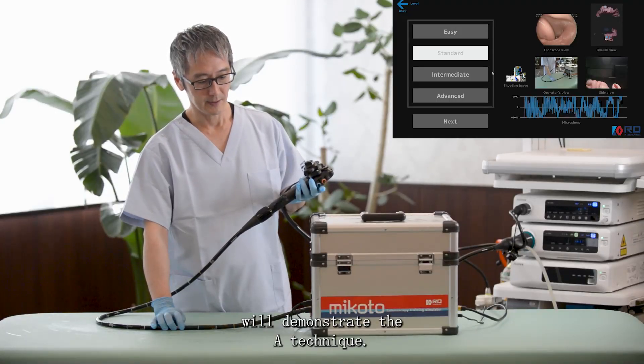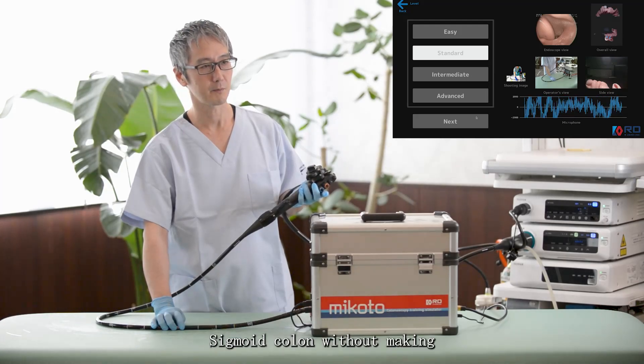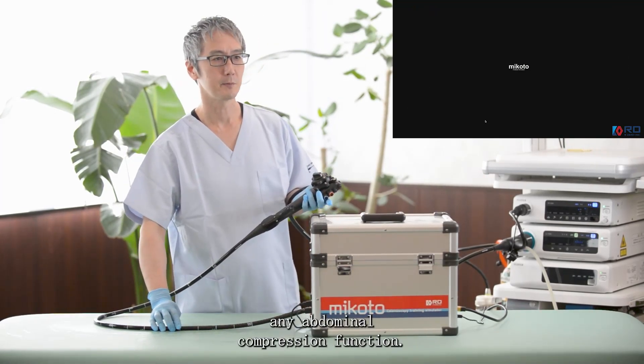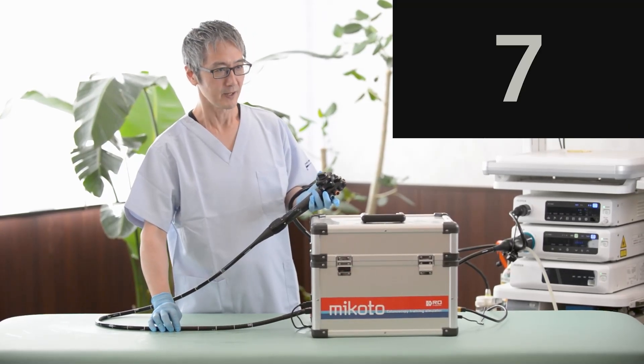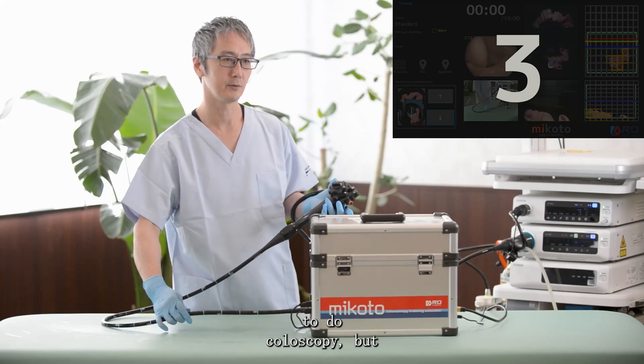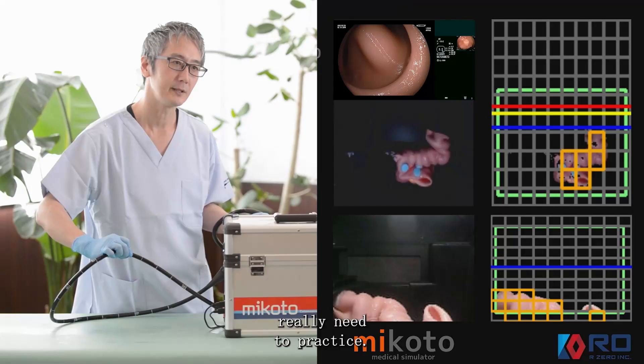Now I will demonstrate the A technique. This is trying to pass the sigmoid without making any loops and also without using any abdominal compression. In reality, this will be one of the most difficult ways to do, but it's one technique that you really need to practice.